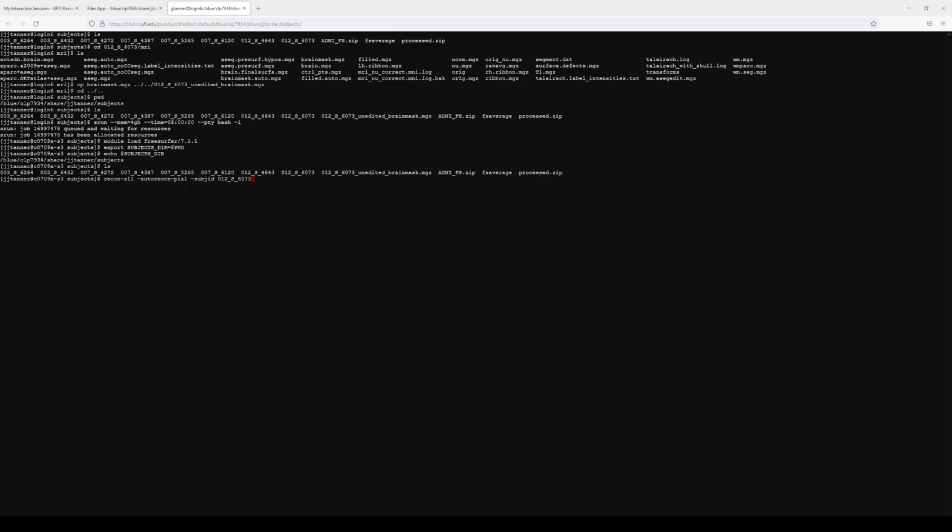So that was fixing some errors with FreeSurfer. Again, spend time with the tutorial for the homework. And if you have any questions, feel free to reach out to me.